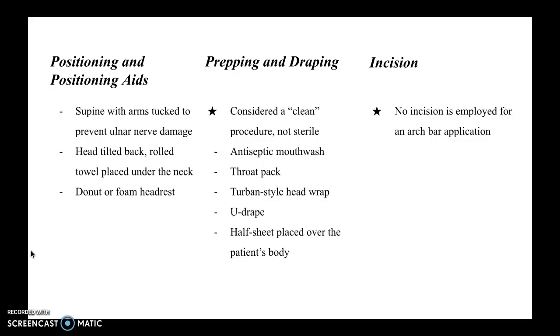And then for the incision, there's no incision employed for an arch bar application because the wire is threaded through the gaps in your teeth, but an incision probably will be made later for a different surgery following the arch bar application.